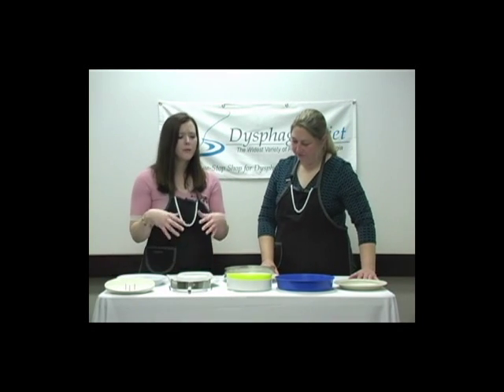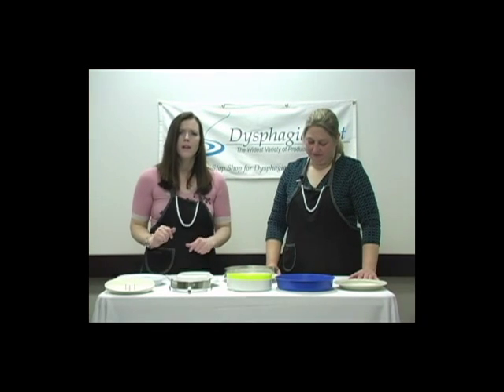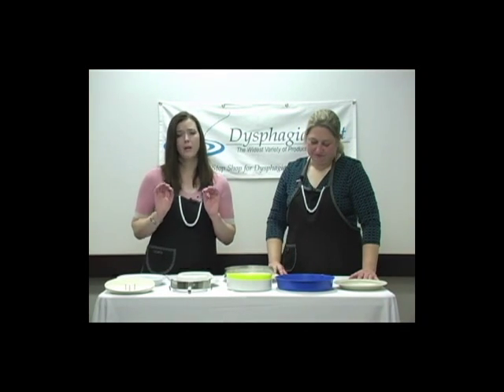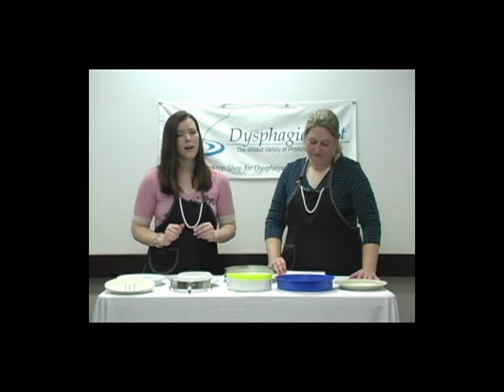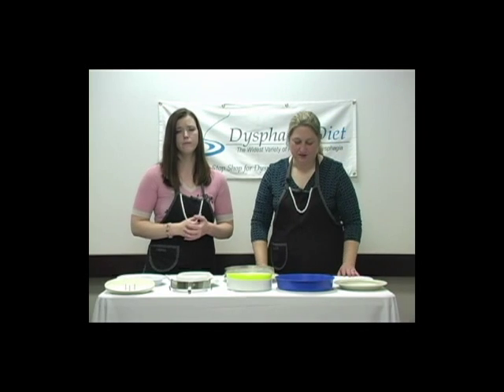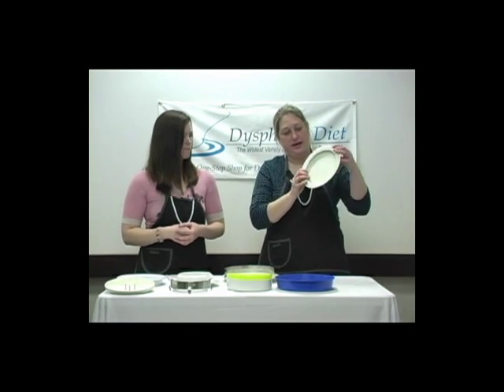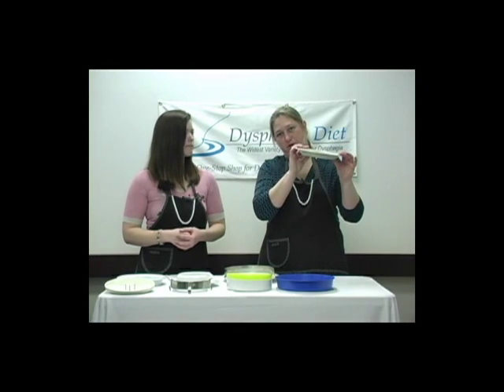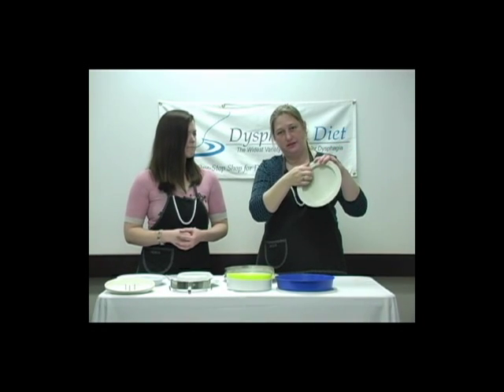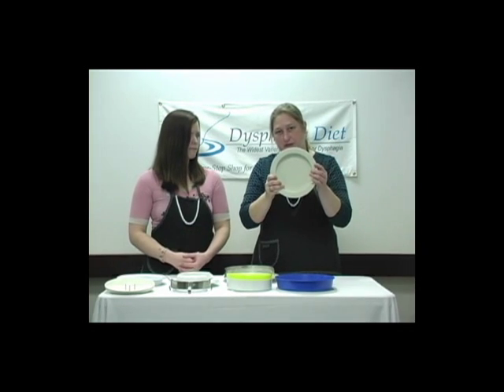And as we're talking about these different adaptive plates, you're probably asking yourself, which one is right for me? If your healthcare professional hasn't already recommended a specific one, you might want to ask them which one's going to best help you out based on your medical condition. Another type of plate we're going to show you today has a lip edge. The lip edge is a little lower plate than the regular high-sided dish. However, it still has a lip that will help you easily scoop food out of the dish without spilling.